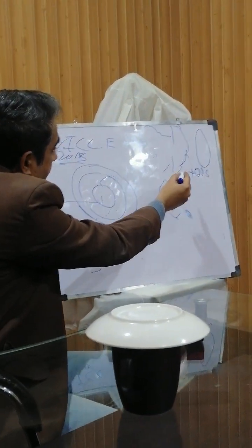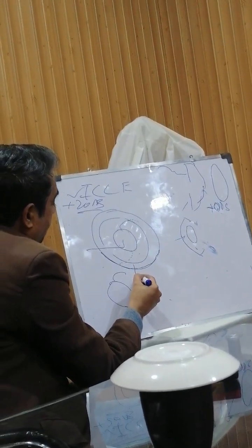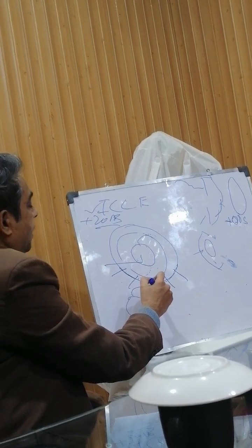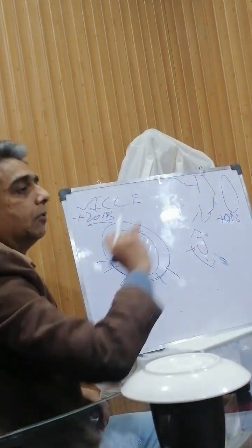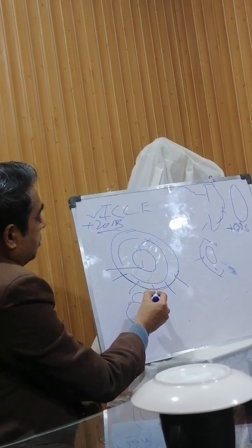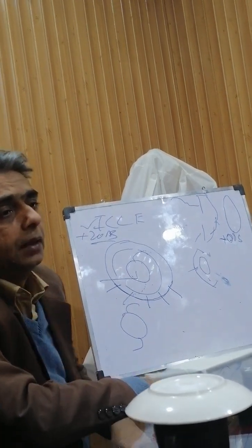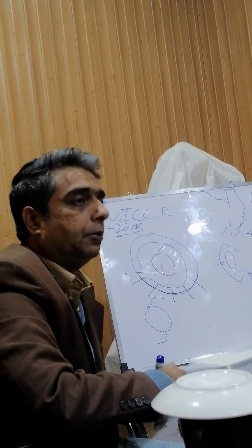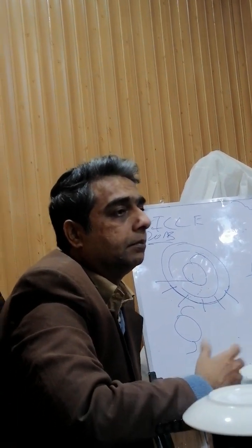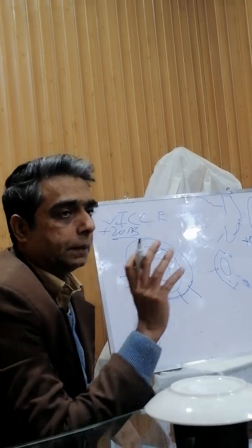And then we apply, as in intracapsular, extracapsular, five sutures, one in the center, one here, and five here. The same five sutures were applied when we performed intracapsular, but the lens was not there. Now, after applying five sutures, some of the sutures might be tight, some might be loose. On the first post-operative day, the patient's vision is pretty good, maybe 6/18 or something, but he might be having astigmatism because, for example, this stitch is tight, so he will have astigmatism in a specific meridian.